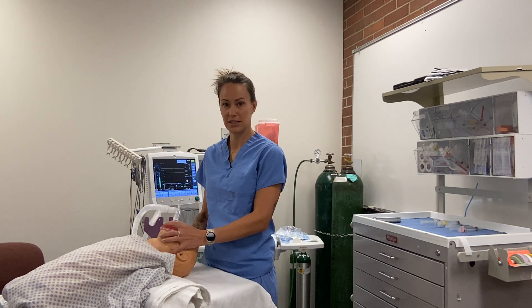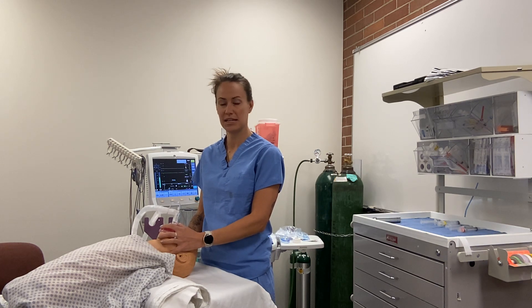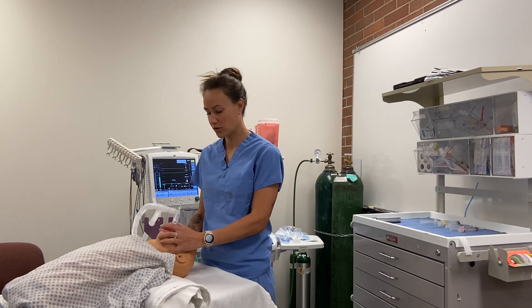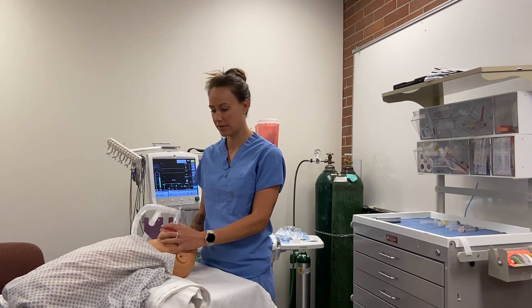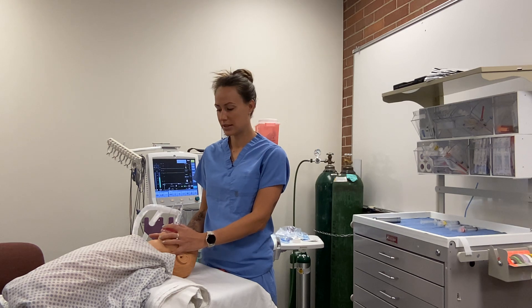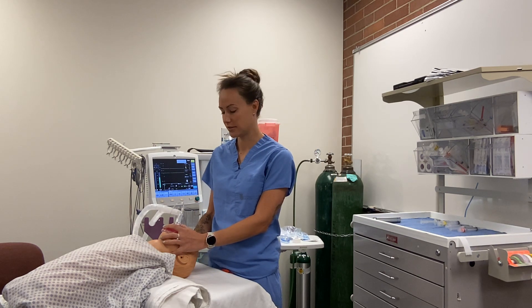During these inductions, we go through Stage 2, which is the excitation stage. This stage is where the patient is at risk of laryngospasm. We would know laryngospasm is occurring because the patient is no longer pulling air — tidal volumes drop and end-tidal CO2 is gone.